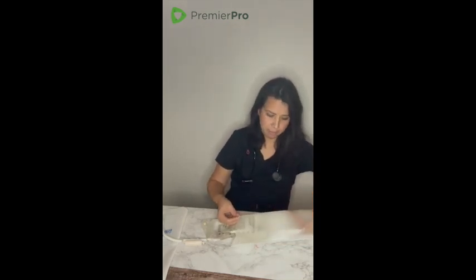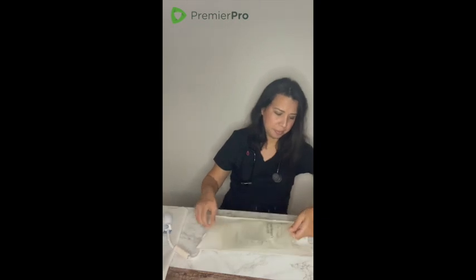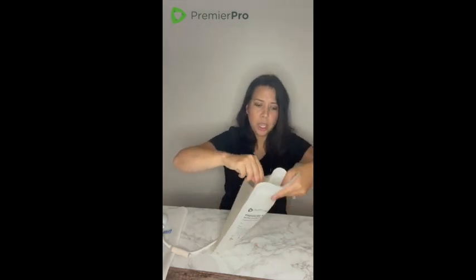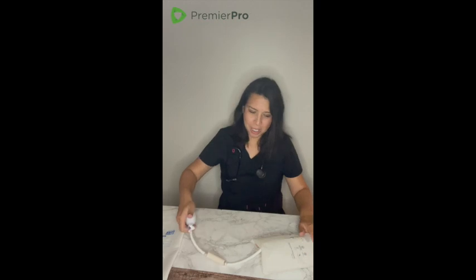I'm going to make sure that the wording on the bag is facing up so that it's visible through the backing. All of our bags come with an integrated hook, and I'm simply going to hook the IV bag on, and now my bag is ready to go. I would hang this up on the IV pole and begin my inflation. But since this is for demonstration, we don't have an IV pole today. We're gonna just lay this on the table. All right, I'm gonna start.